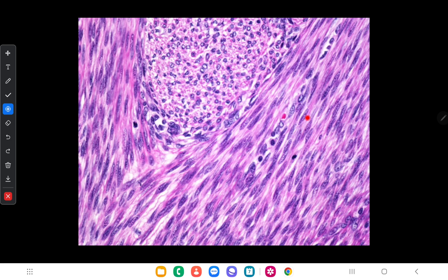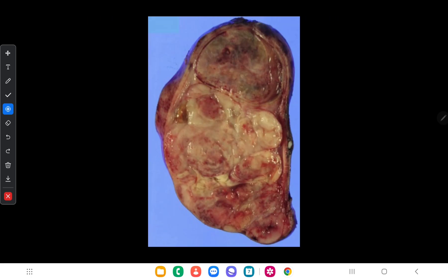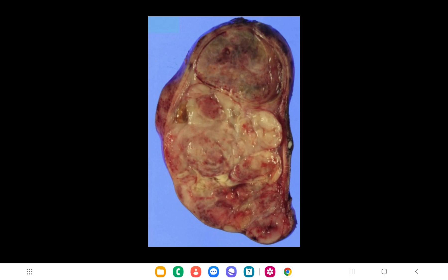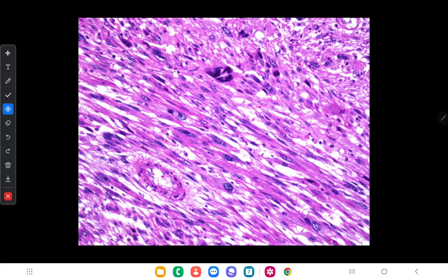The microscopic appearance of leiomyoma shows it is composed of intersecting smooth muscle bundles. In leiomyosarcoma, you can see hemorrhages and necrosis in the cut surface; it is not whitish as in leiomyoma and appears as a bulky and fleshy tumor. Microscopically, leiomyosarcoma shows enlarged pleomorphic nuclei and increased mitosis.